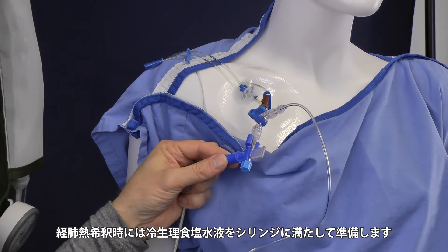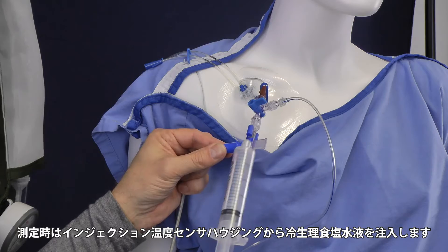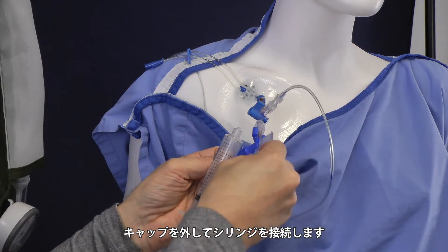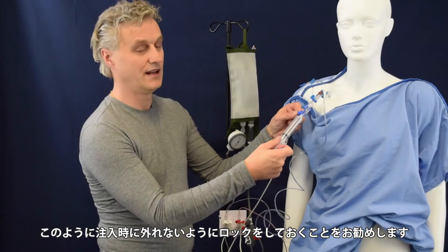The last thing you need is a prepared cold syringe with saline. You will place this one where the blue cap is. Take off the blue cap, place the syringe and connect it clockwise, like this.